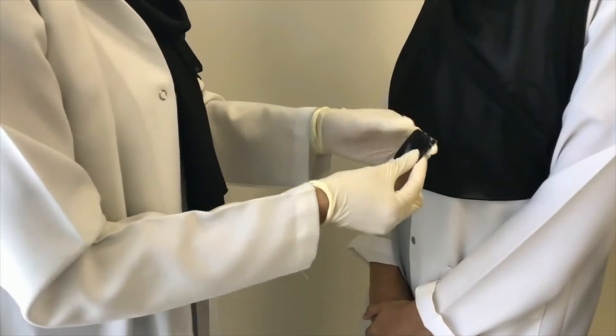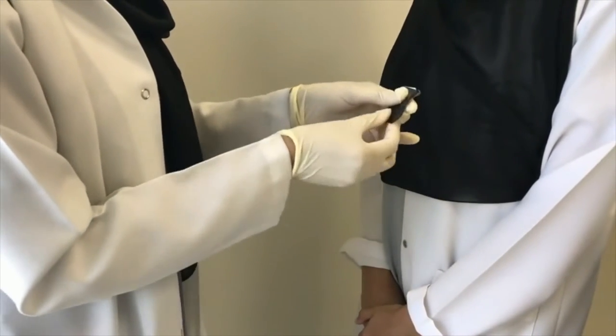After exposure, the film is removed from the protective barrier and is ready for processing.